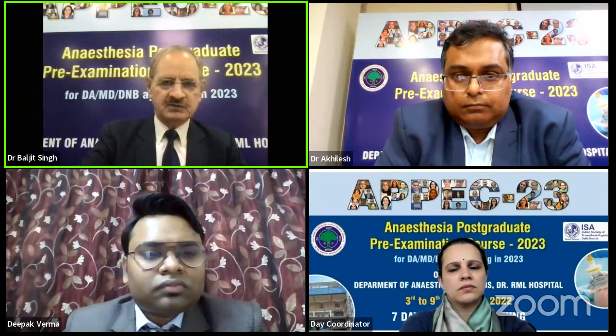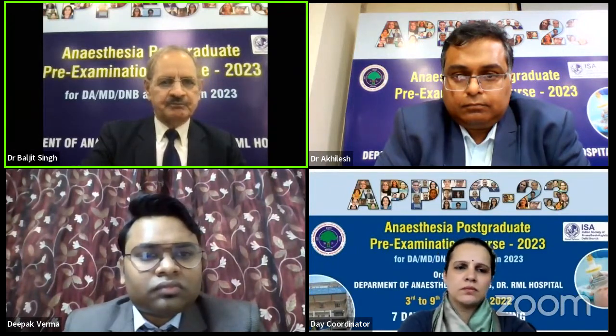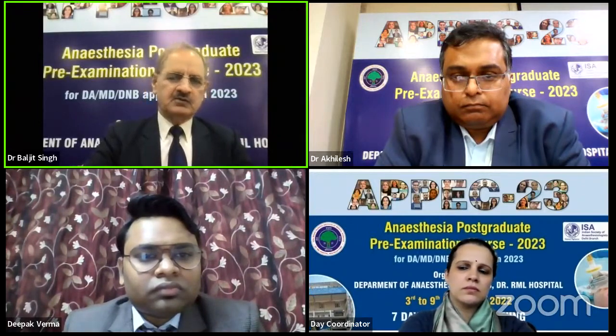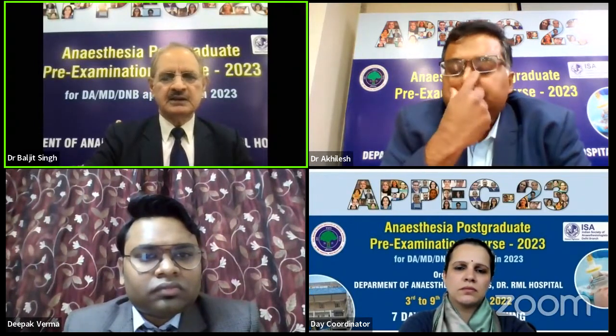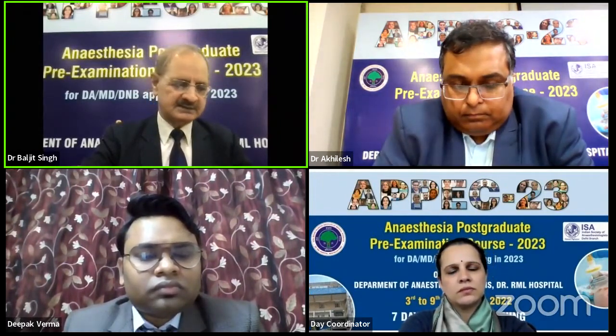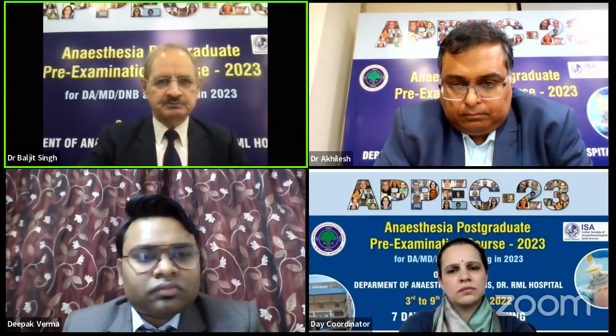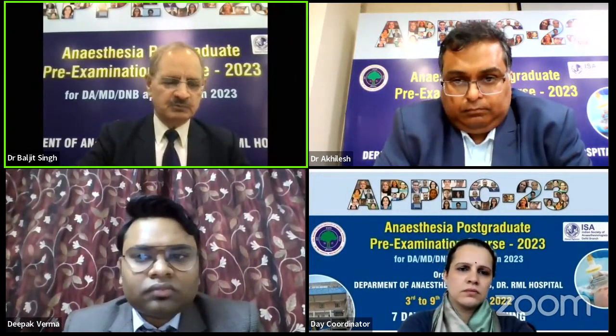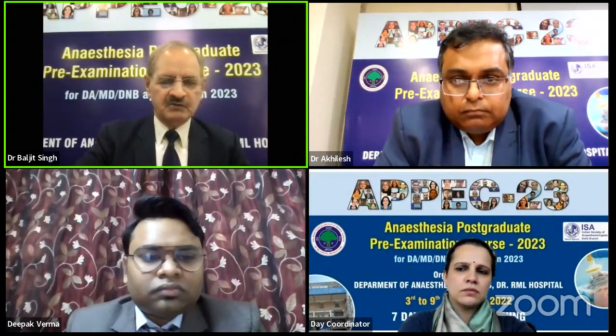Because of this, there is more stress on low flow anesthesia. This is to ensure that the leakage of inhalation agents to the environment is as little as possible, so that not only the people delivering anesthesia to the patient, but other persons present in the OT at that point of time are also safe.